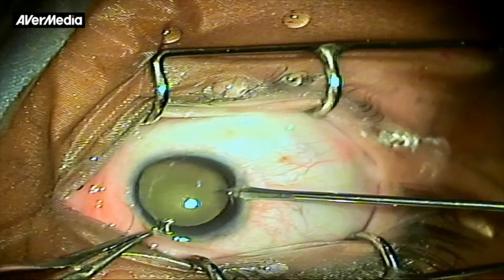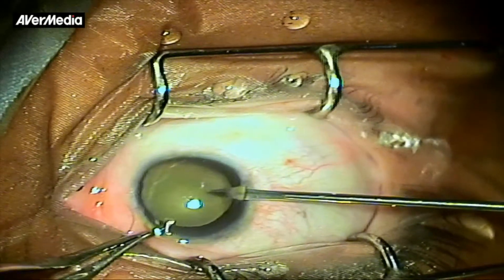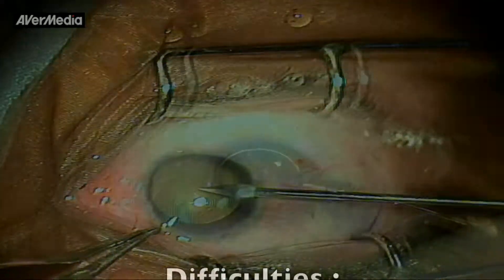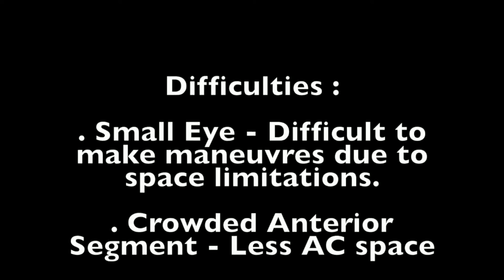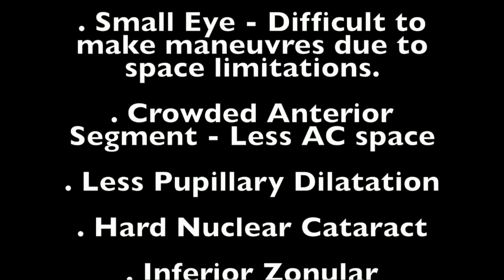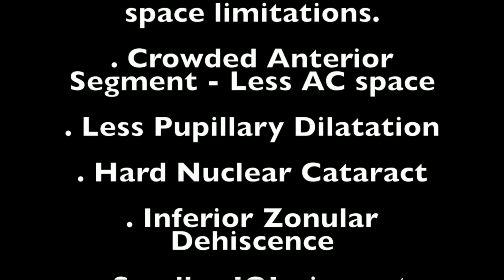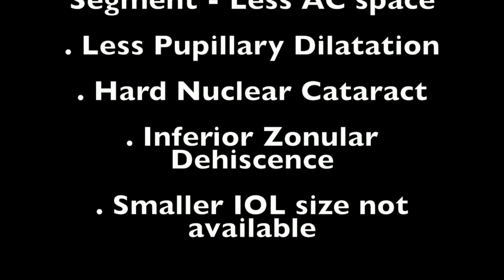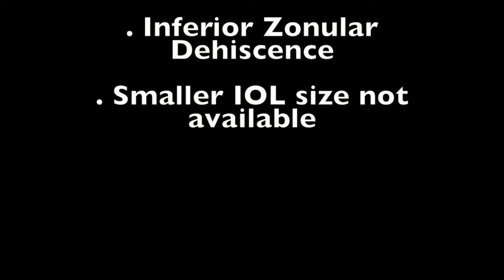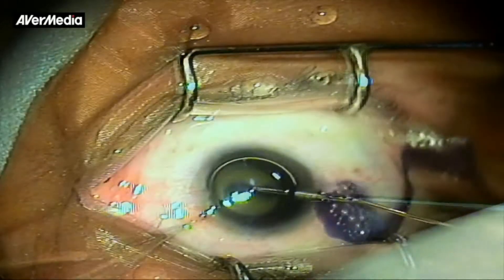This is a case of severe microphthalmia with coloboma, with a horizontal corneal diameter of around 8.5 mm. There are various difficulties in such a case: the eye is small and offers a crowded anterior segment with less space in the anterior chamber. Pupillary dilatation is often less than optimal, the nucleus is hard and usually brown, and many times there is inferior zonulodialysis. An IOL of suitable size is usually not available.